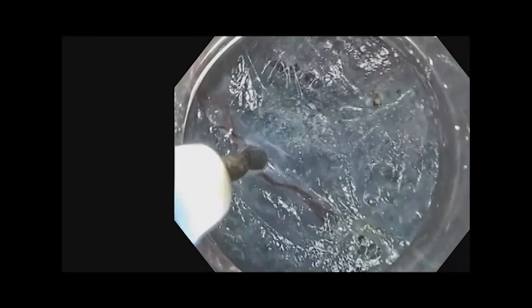In this video of endoscopic submucosal tunneling during gastric peroral endoscopic myotomy, we can see how the use of this image enhancement facilitates the recognition of submucosal vessels. This allows for targeted preemptive coagulation and thereby reduces the risk of intraprocedural bleeding.